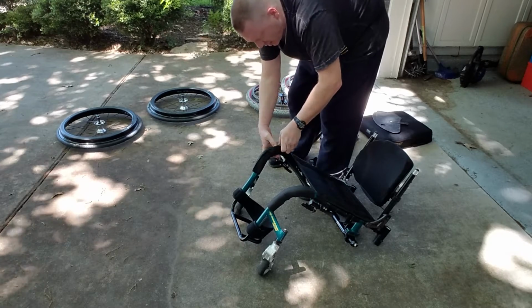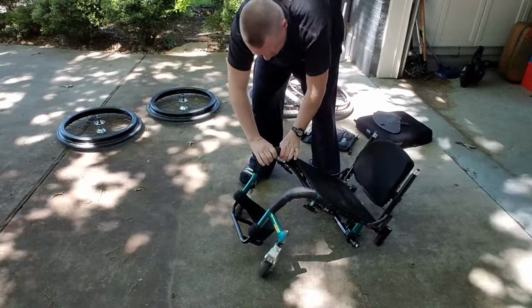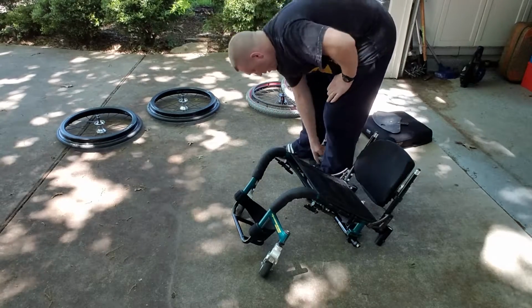Velcro's on. And a lot of this stuff, like this right here, once you've done this, it's not like you ever really take them off. You just pretty much leave them like this all the time, and they provide padding right here on the chair.